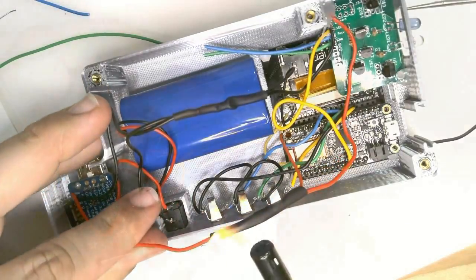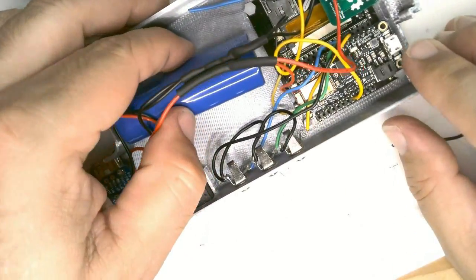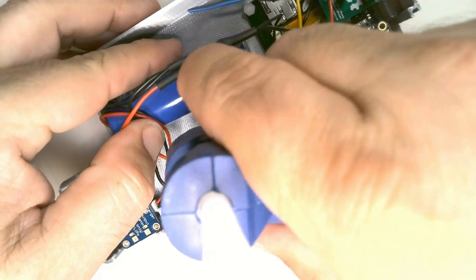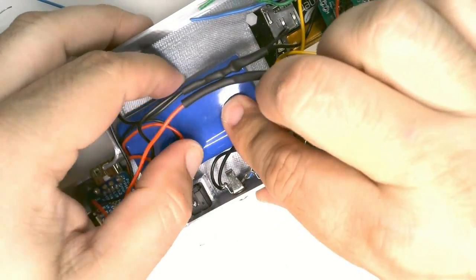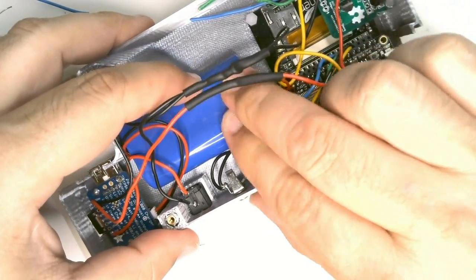Finally, we're going to secure the battery in place using hot glue. Don't use permanent glue because at some point you'll want to replace the battery. The battery needs to be placed as close to the AT jacks as possible to make room for the mounting nut that extends from the lid on the other side.